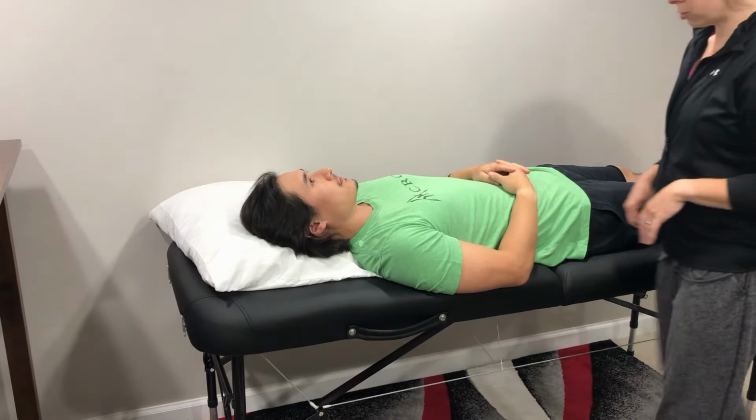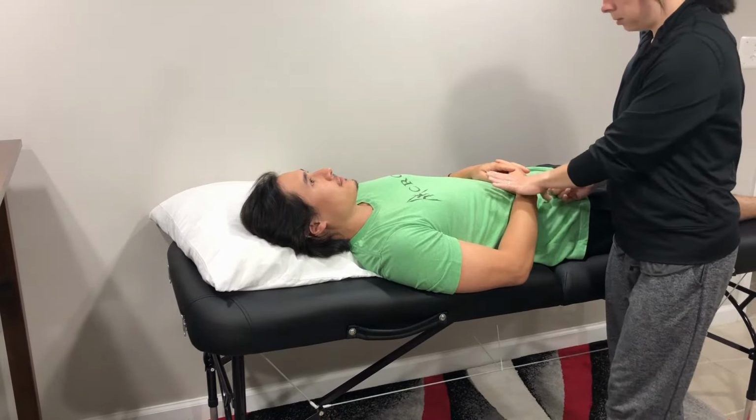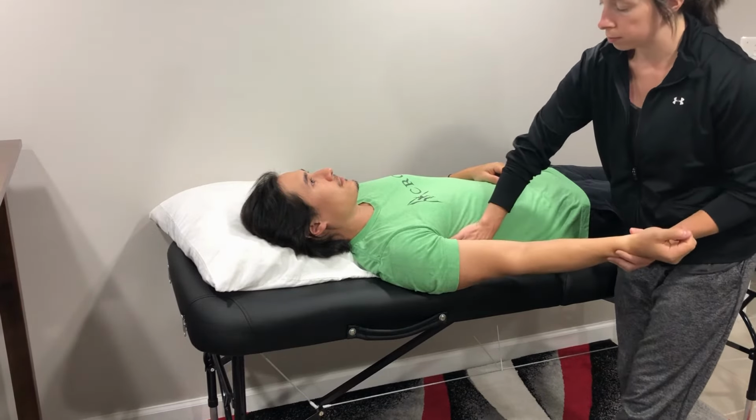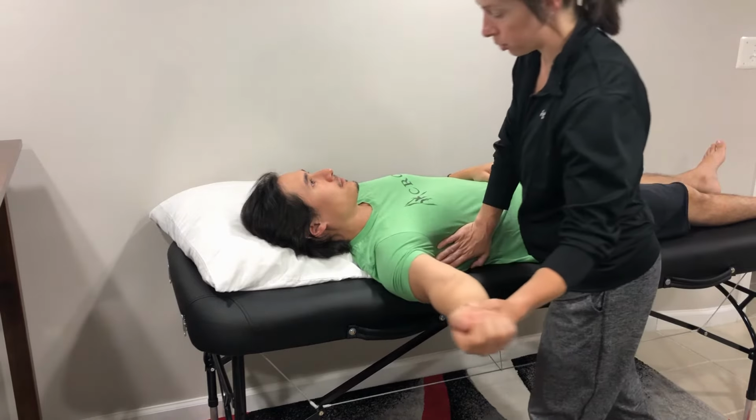Measuring abduction of the shoulder joint. Patient is supine. Take the arm. I'm going to stabilize the lateral aspect of the thorax as I bring the arm up to check passive range of motion.